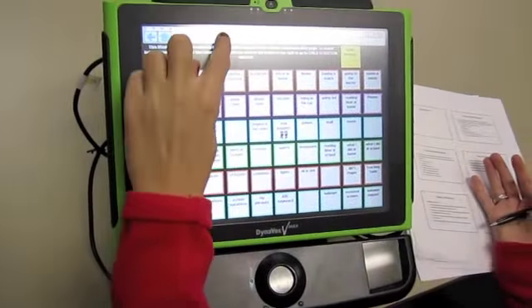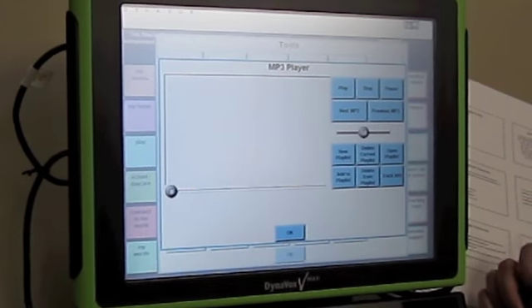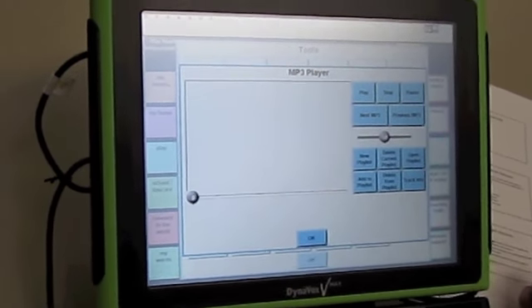It can also act as a camera, so that's really cool. Email and text messaging, you can set up your own email account in the tools menu too. So options, you would enter in user information, logon information, and then information on the server to connect your email to the device. And it can work as an MP3 player. You can upload songs and listen to them through your device. And you can also look at ebooks.